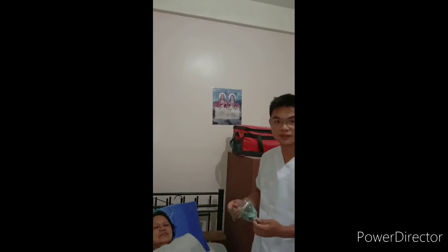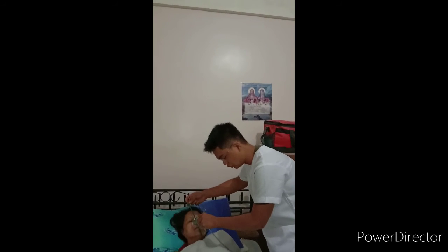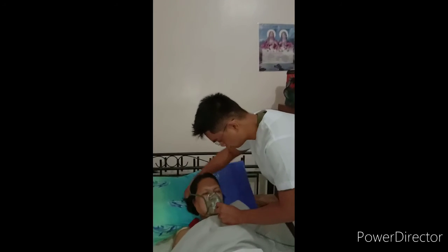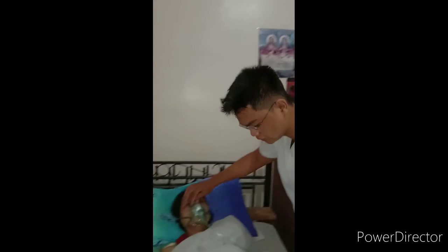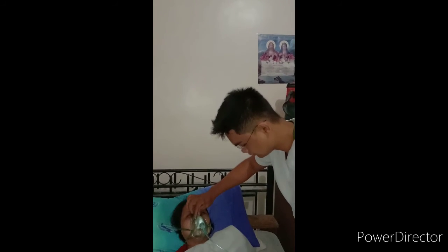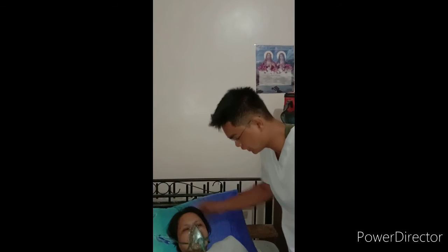Place padding beneath the tubing as necessary. Using the mask, place it on the face, applying from the nose over the chin. Next, adjust the metal piece over the nose and contour the mask to the face. Adjust the elastic band around the head so the mask fits securely.